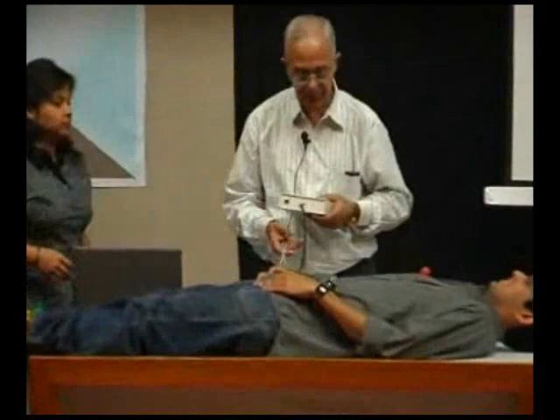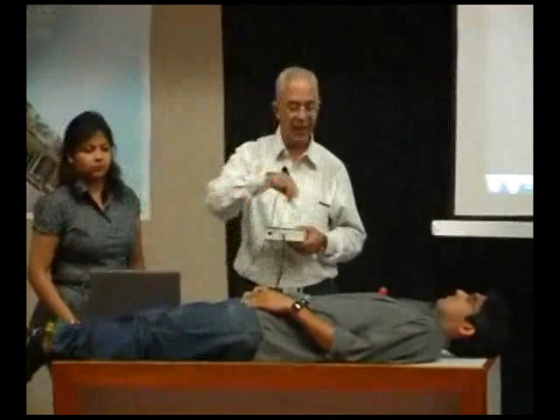So again, the methodology that we followed: little modules, whatever goes into it, are developed by several students, and then we integrate all those. Most of the hardware in this has been replaced by software. There is a microcontroller that contains all that. That is why the cost is so low. And as I said, this weighs only 200 grams. It connects the leads to the arms and the legs and one chest lead, and it connects via a USB port to the computer.